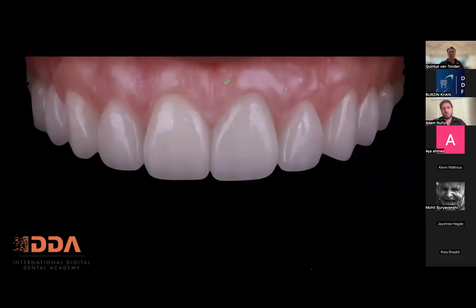You can see how nicely the gum has filled up all of those interproximal areas. A very important thing is that we keep our contacts interproximally very long and straight, as long as possible. I can't remember the research now, but I saw an article the other day about the papilla growing better into the interproximal area if your contacts are longer and flatter in between the teeth. So for this patient, it was a really nice result.